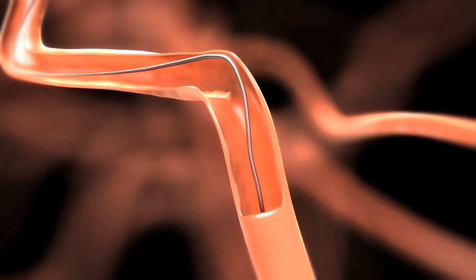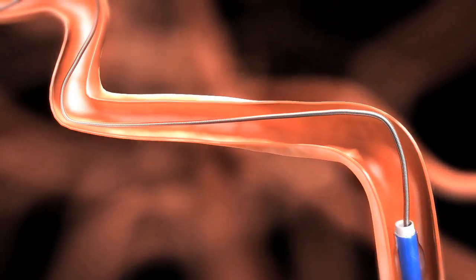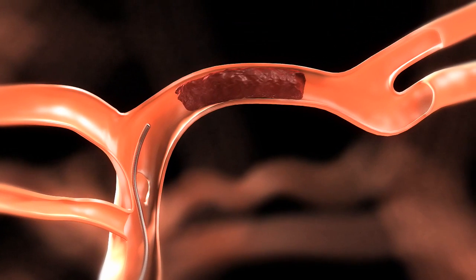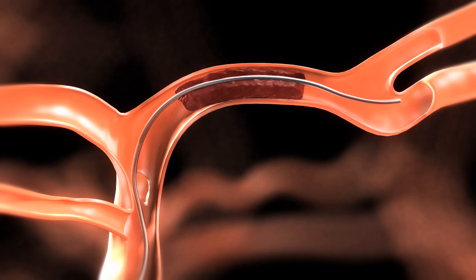Position the balloon guide catheter as close to the thrombus site as possible. Connect a rotating hemostatic valve, or RHV, to the fitting of the guide catheter, and then connect the continuous flush.